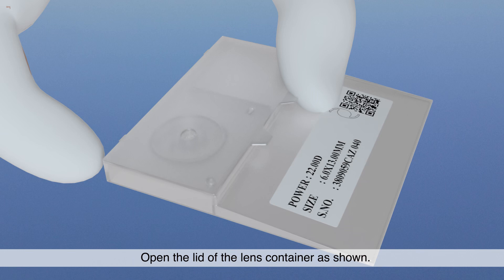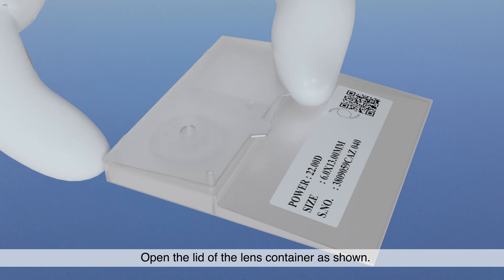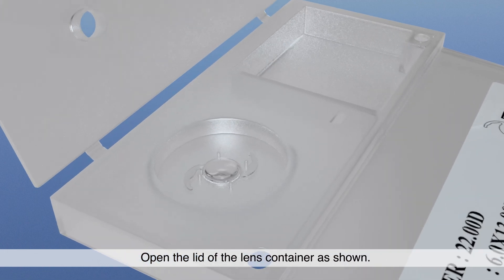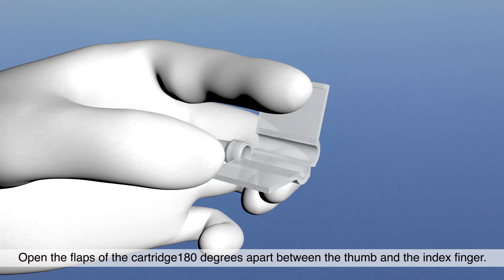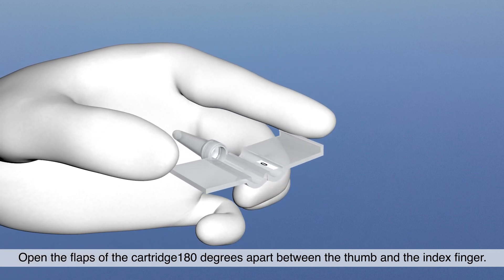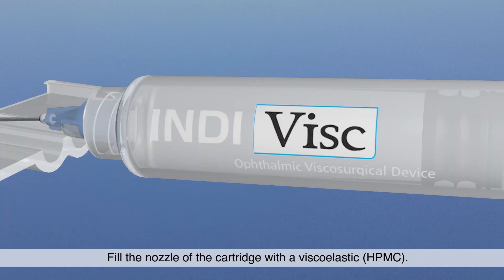Open the lid of the lens container as shown. Open the flaps of the cartridge 180 degrees apart between the thumb and the index finger, as demonstrated. Fill the nozzle of the cartridge with a viscoelastic.